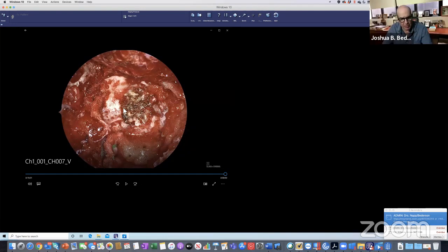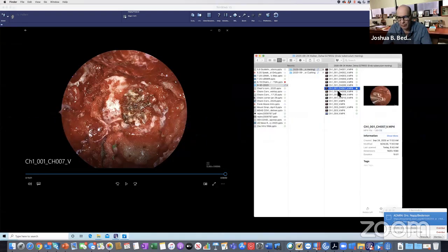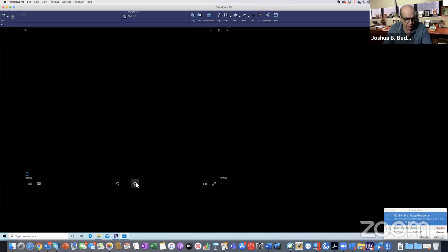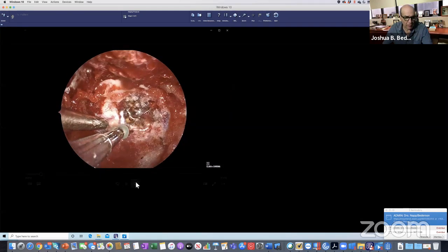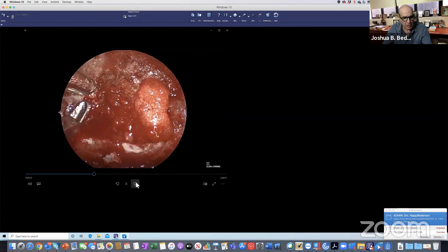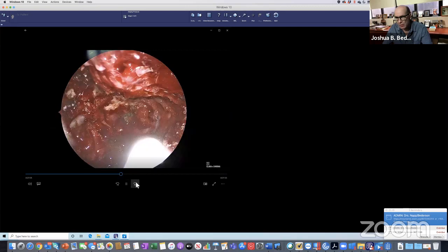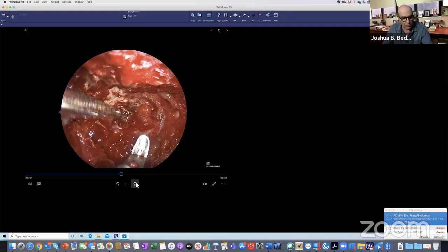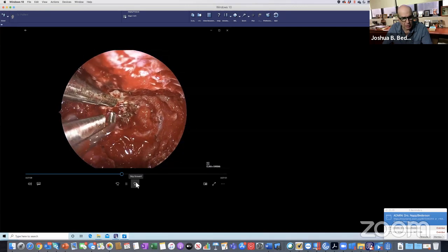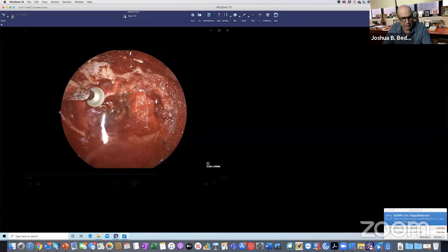You've got both carotids. You've got the bone open almost all the way up. But still that's not enough, because I want to see, if we know where the carotids are, Travis, why would we want to expose the bone over them? What could be gained by that?